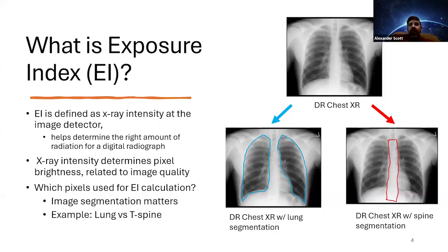It could be a chest exposure, and in that case, if we were wondering, is it correctly exposed, we'd look at the lung field, which I've outlined in blue as best as my shaky hands can do. And we could see that looks probably properly exposed.